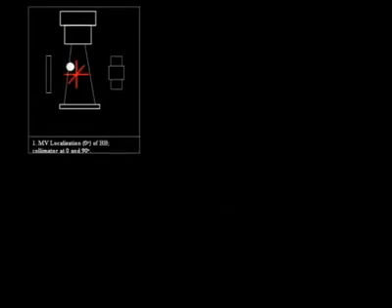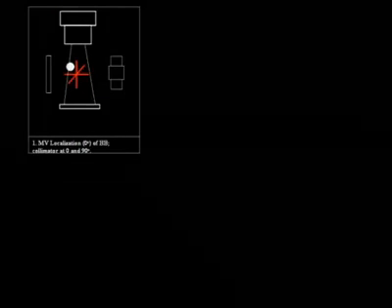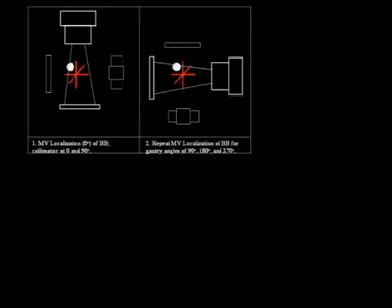So this is a cartoon that actually shows this procedure. One starts by placing a high contrast object near the isocenter, as close to the isocenter as possible. And here the isocenter is signified by these 3 red lines, which are not laser lines in this particular case. But one can certainly align the object to the laser lines to start with. And then portal images are required of this object in order to define its position with respect to the beam edges, telling us where the object is with respect to the intended radiation isocenter.